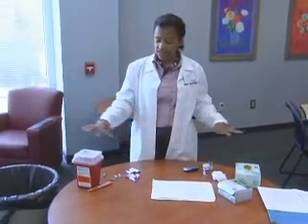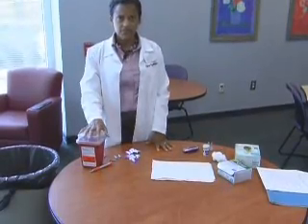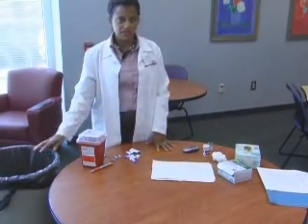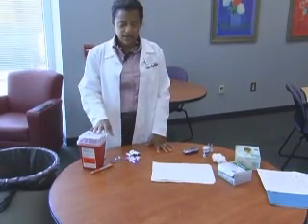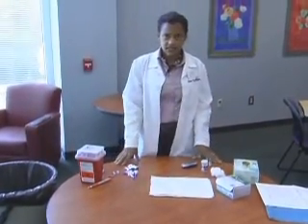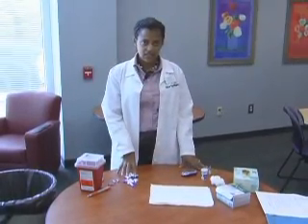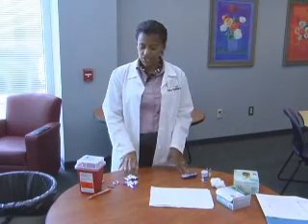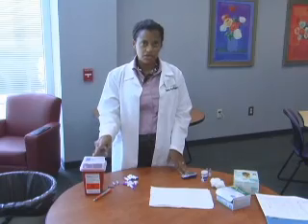Notice how I have the table set up. I'm right-handed, so I have my sharps container right next to my right hand as well as my trash can. I like to keep my work area very clean because this is how accidents and needle sticks can happen. After you use your lancet, before you start to worry about running the test, you want to throw the lancet immediately into the sharps container.